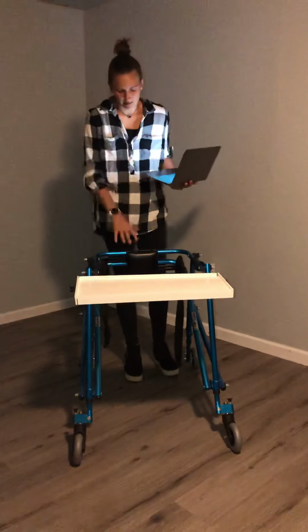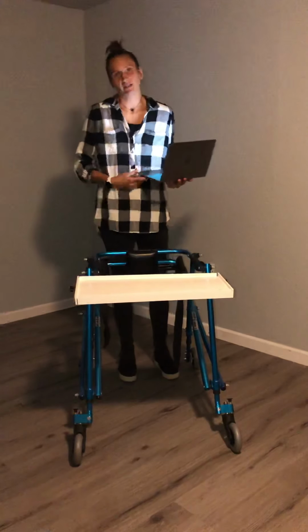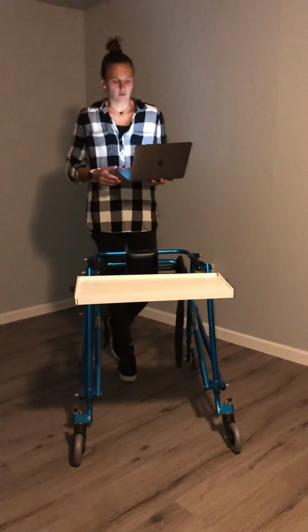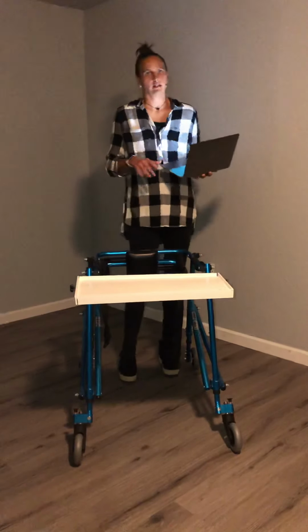So for this specific walker, it's a size large, which is going to fit a weight capacity of 190 pounds. It's going to fit someone that's between 54 to 68 inches tall, and that's going to usually be someone that's approximately 10 to 18 years old.